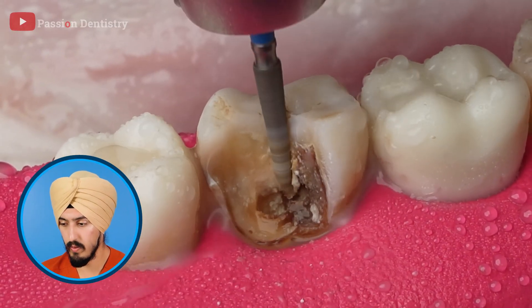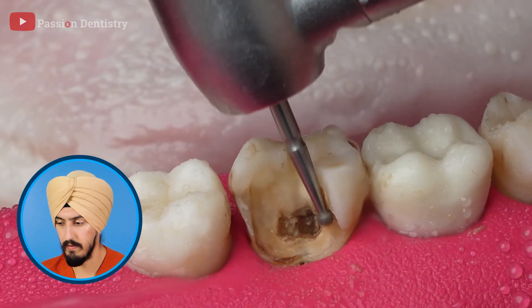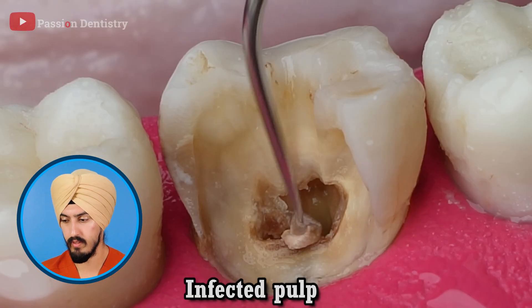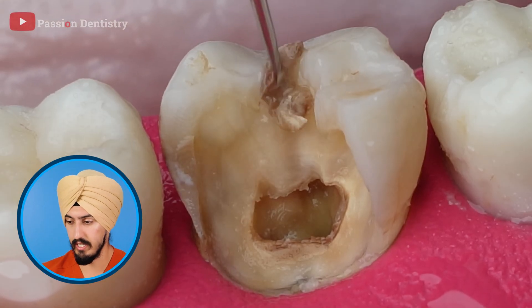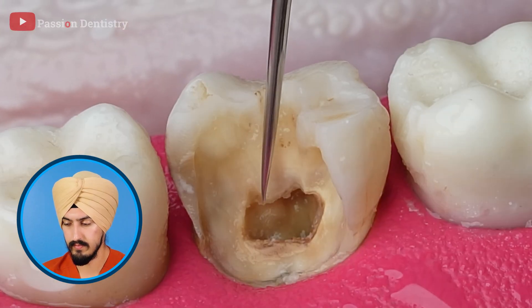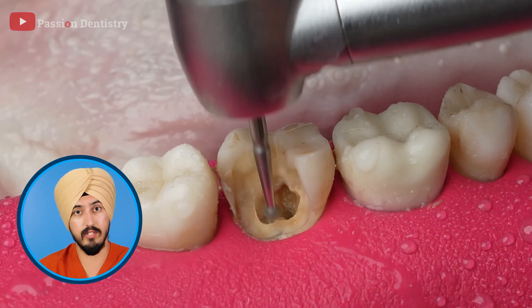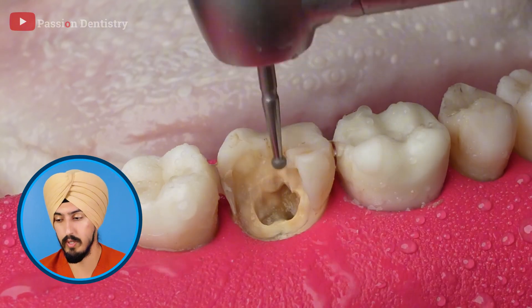So now he's just cleaning more of the tooth structure away. Fast forward a little bit — look, it's getting a lot cleaner and you can see that actual pulp chamber. That's the infected pulp — the part of the nerve tissue that's getting infected — that he's cleaning away. And now he's taking this called an endo explorer, which is kind of finding the canal. You have these little canals inside those roots that are basically feeding the blood supply to the tooth, and that's where you're going to clean when you do a root canal.